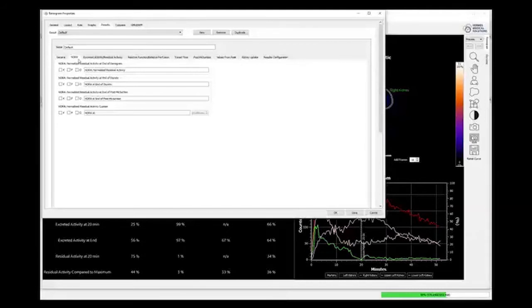But going back to what you were saying about different markets having different protocols, different workflows, that's something that I'm going to mention later on as well. Because some of the new functions that we have are in response to popularity from other regions such as the States. They're growing in popularity, so they may cross the pond eventually, so it's good to have that functionality available if our customers in the UK want to consider trying it.